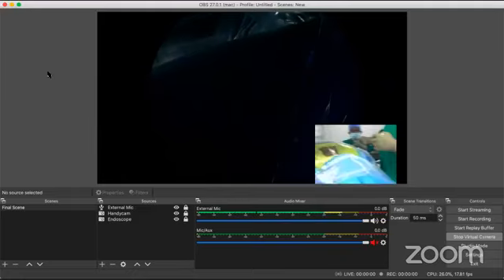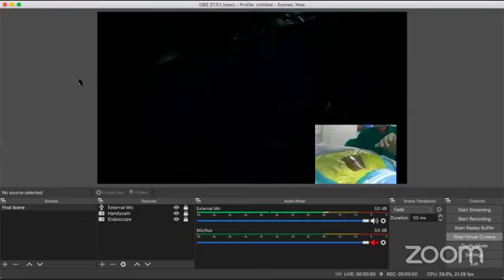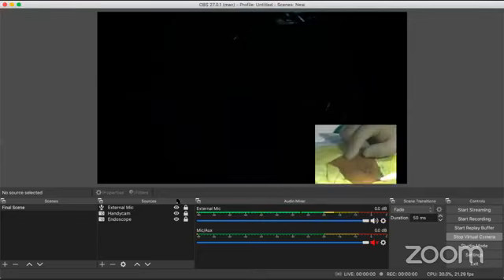Can you put on the OT? That's a little okay. It's a little dark, but yeah. Can you see over here? I have marked the midline.